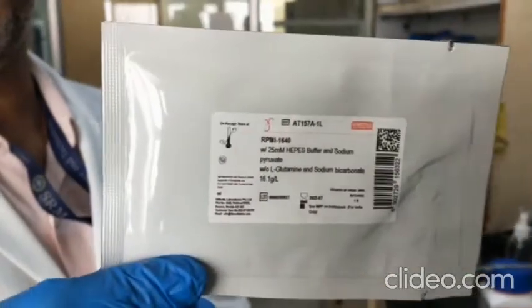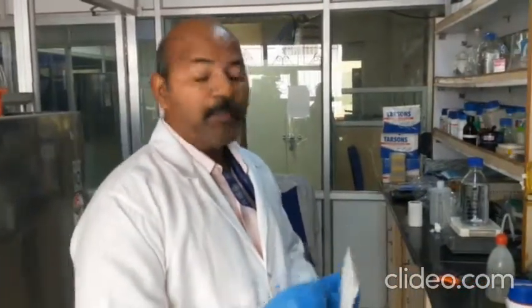This is the media. You can commercially get it from the company. This one is sourced from HiMedia. Other companies like Sigma-Aldrich, Thermo Fisher, and other companies are also supplying this kind of media. You can get it as a powder form, which will be cheaper, and you can prepare it at your laboratory itself — your own media.